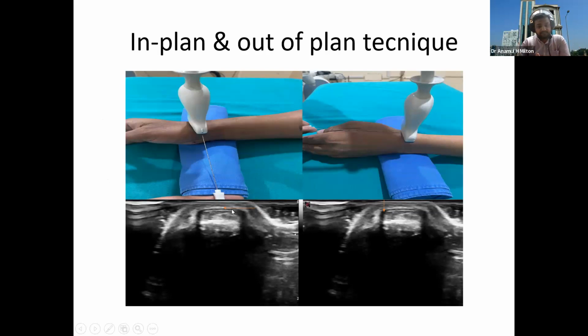So it is the in plane view. Okay. So it is the out of plane, you can go through everywhere, but not within the tendon, just outside the tendon, because if you are going for steroids, at that time you do not do any intervention with the steroid within the substance of the tendon, because it causes damage of the tendon.